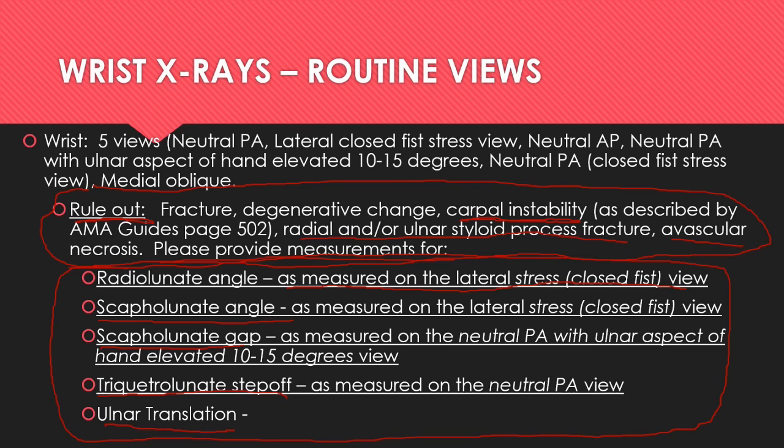Always, always, always take your own measurement findings, because you want your impairment ratings to always be based upon your own observation of the X-ray images and based on no one else's observation of the X-ray images. Okay? So when you get these X-rays, we're going to compare the measurements provided by the medical radiologist to the AMA guides.